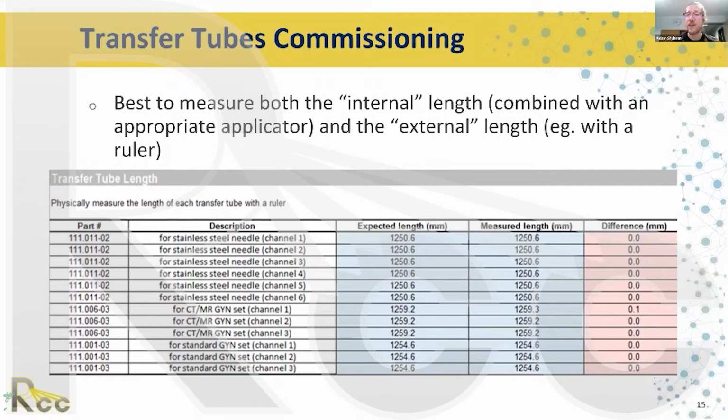So, for example, back to my applicator, I've measured exactly 1,500 millimeters for my system. It might be different for yours. Each manufacturer is different. And I saw that my offset was perfect. And then I put in my length guide simulator through my transfer tube and applicator, and it measures 1,502. But that's okay, because my gold standard was the autoradiograph.